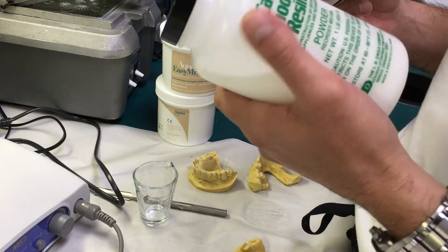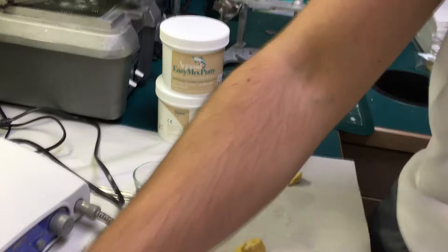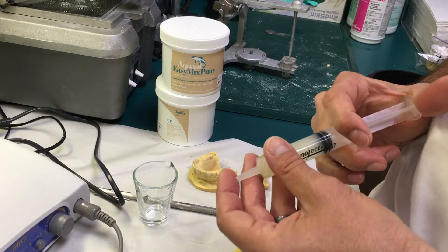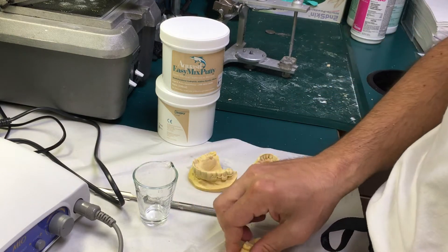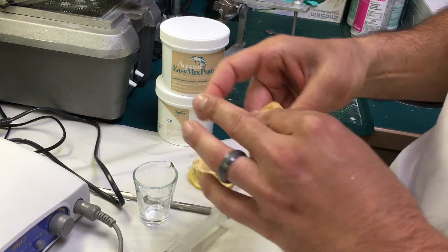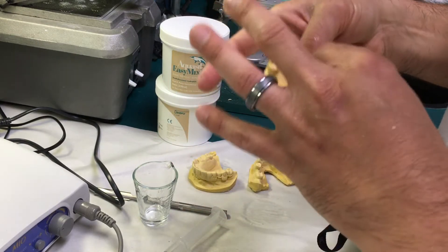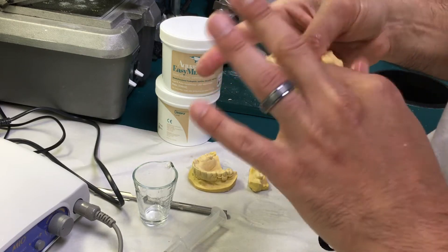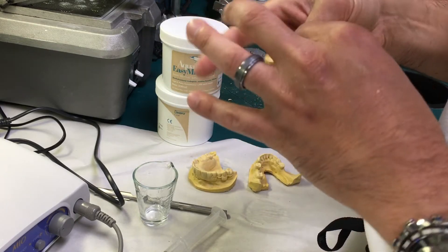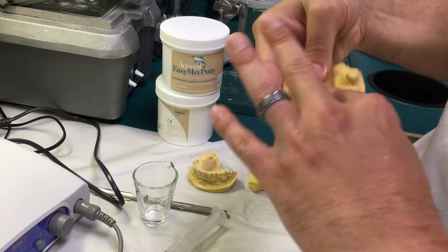This is clear powder for ortho, so it can be clear. I'm going to start by basically applying some Vaseline on the cast that I'm going to be using for the guide fabrication. If there are any undercuts, you could also use some kind of blocking medium — anything from Play-Doh to resin to wax to whatever you prefer. I'm going to be rather generous with that.